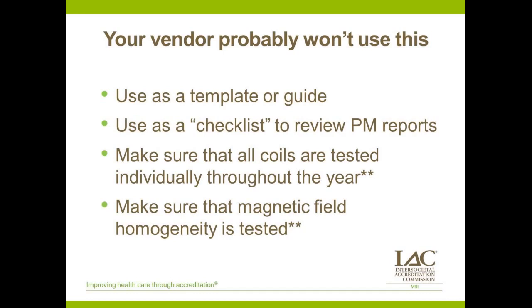Some companies will say that information is stored in your scanner, and here is how you can access it and print it out, or export it to a jump drive or something like that. So there's lots of ways to go about this. And if you ask, you may get different options from different manufacturers.